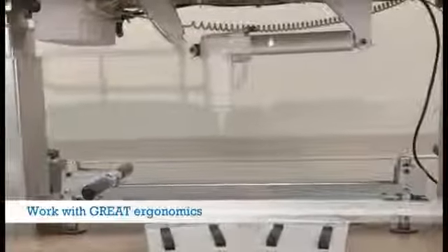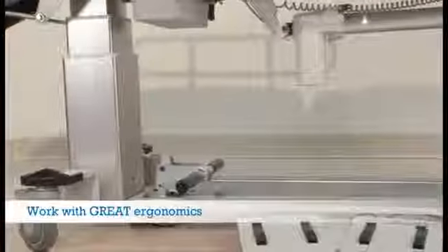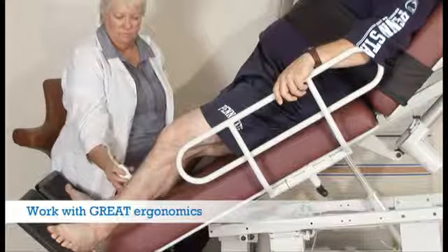Ergonomics and safety are the top priorities while ensuring the highest level of safety for your patients. All Oakworks ultrasound tables are designed to lift 600 pounds, allowing you to position your patients at the best height for your work.